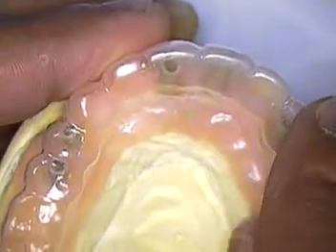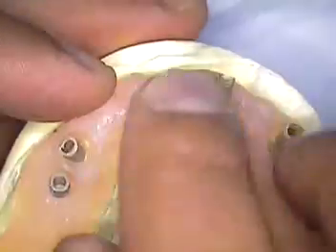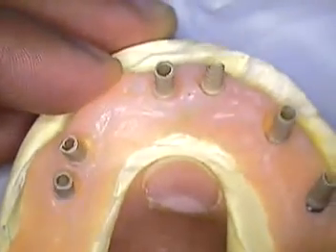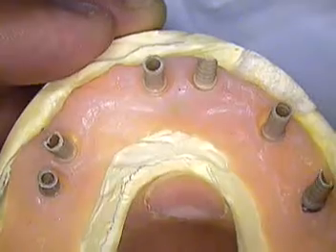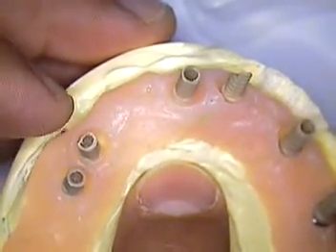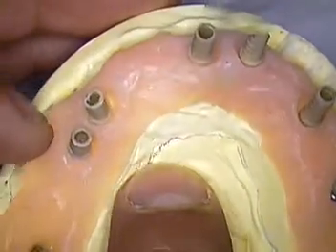The main reason why we are doing this is not only to get an image of the angulation of each one of these abutments, but the company that's going to make the angled abutments is going to do it via a computer milling device. They're called Atlantis abutments, and I believe Astratech is the company that makes the Atlantis abutments. So we're going to do that in this case.